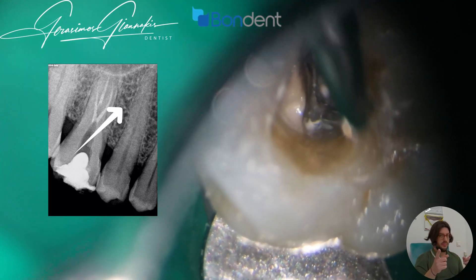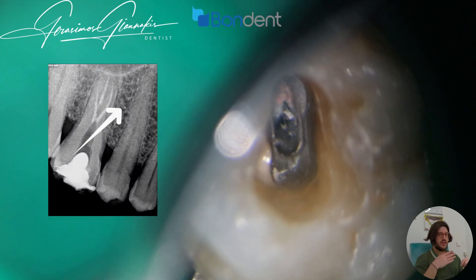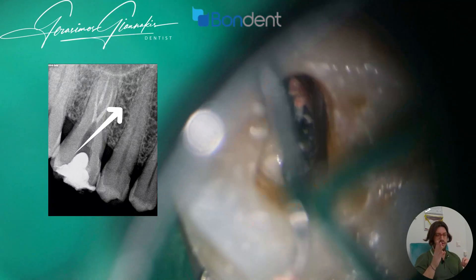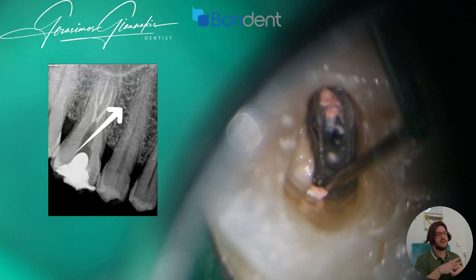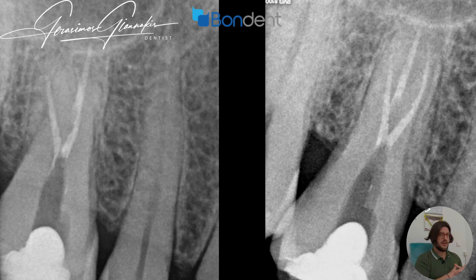Very important tip: if you see that the buccal canal has an orientation that diverges from the central line, this most probably means that we have another buccal canal diverging in the other direction.